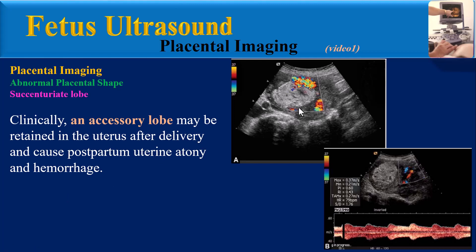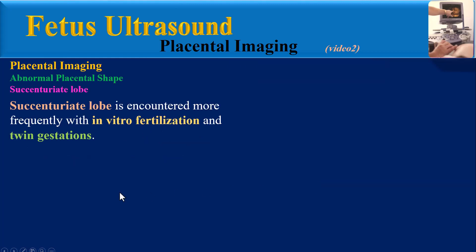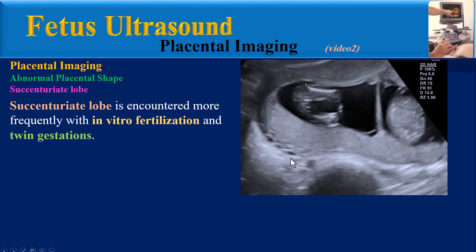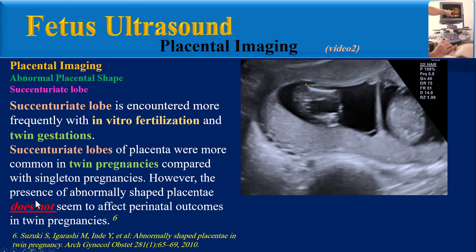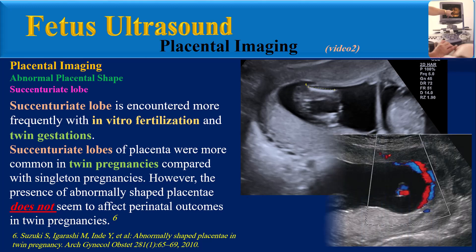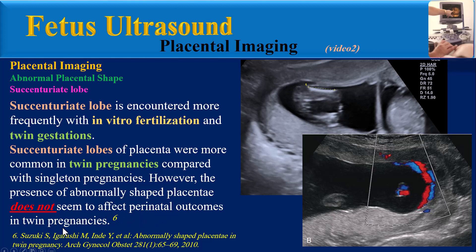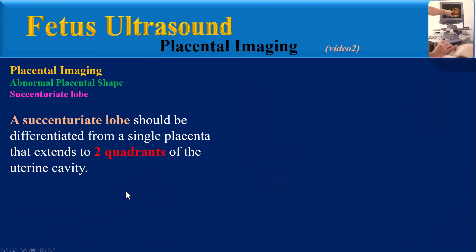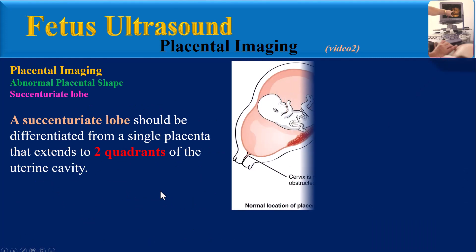This transabdominal transverse scan nine days postpartum shows retained placental tissue seen as an echogenic mass, with low-resistance blood flow on one side of the mass. Succenturiate lobe is encountered more frequently with in vitro fertilization and twin gestations. One study showed that succenturiate lobes were more common in twin pregnancies compared with singleton pregnancies; however, the presence of an abnormally shaped placenta does not seem to affect perinatal outcomes in twin pregnancies.